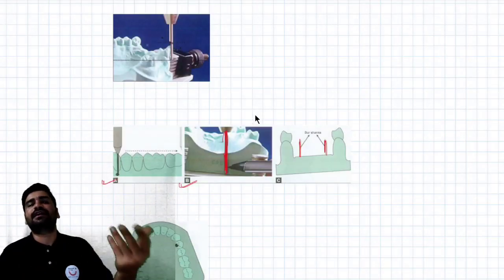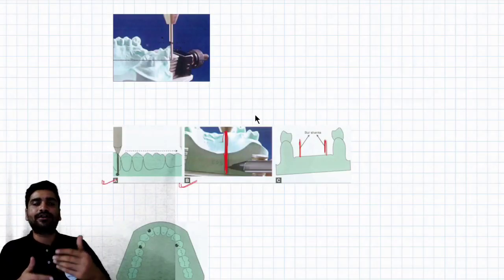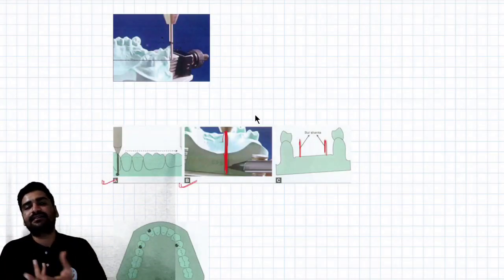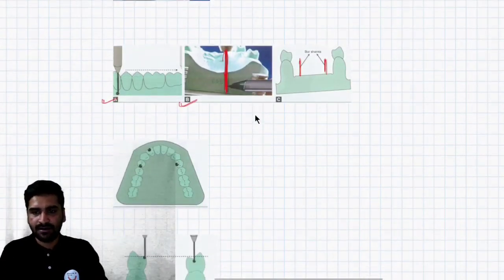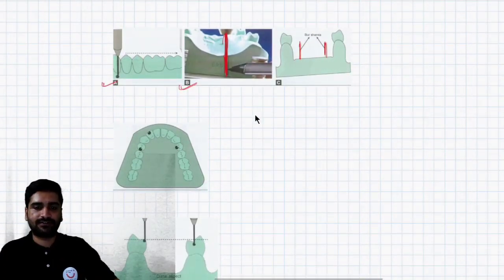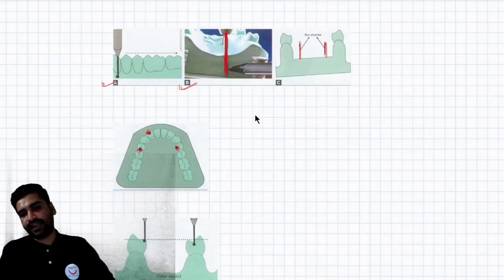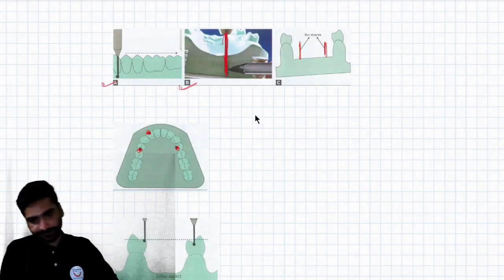Then eventually, as the literature got added upon, there are various authors who gave various ideas apart from marking what we can do. See, you can mark on the surface of the teeth also like this, one anterior and two posterior, right? So that also can be done, okay.